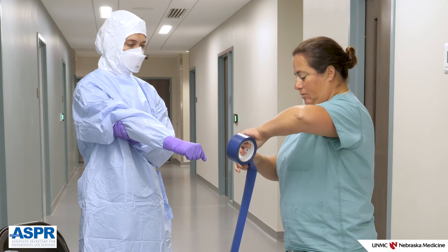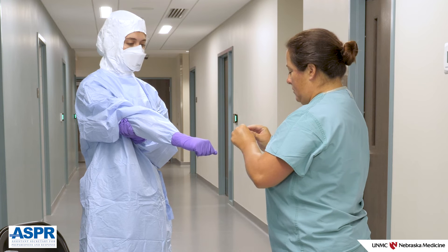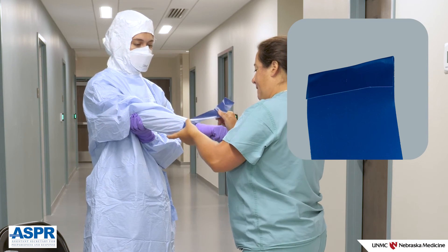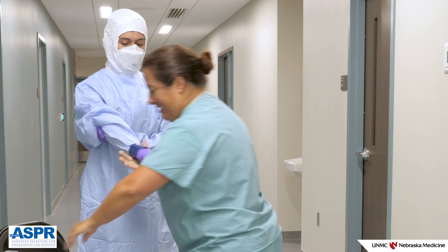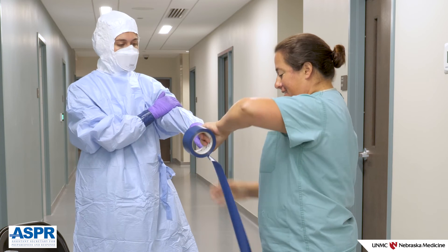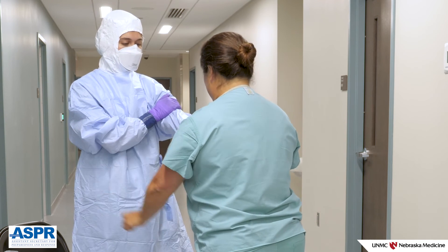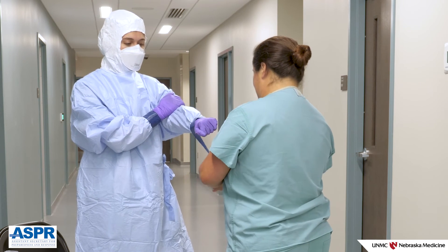To prevent gloves from being accidentally removed or rolling down, your partner will need to tape your gloves to the gown sleeve. To facilitate tape removal during doffing, fold the end of the tape over on itself to create a tab so that the end of the tape is easily found. The tape should overlap end to end on itself, covering the entire area where the glove cuff meets the gown. As the partner applies the tape, the person donning should make a fist to flex their forearm muscles — this prevents the tape from being applied too tightly. Once applied, press down on the tape to ensure it adheres to both the gown and the glove.